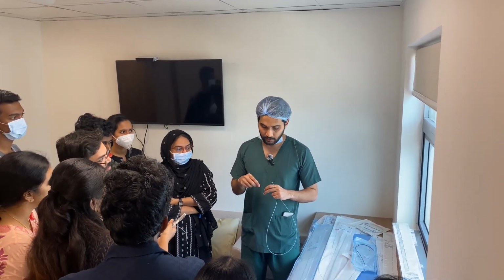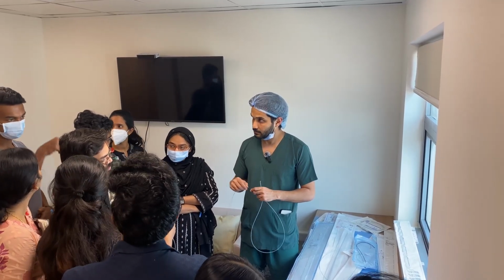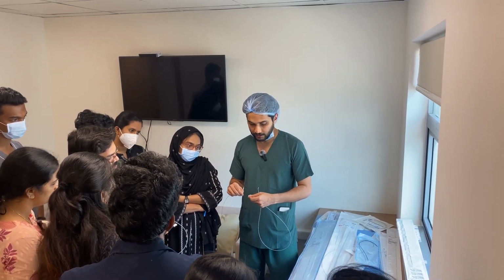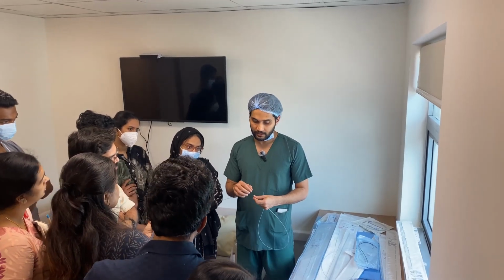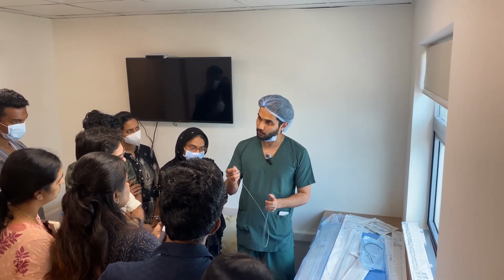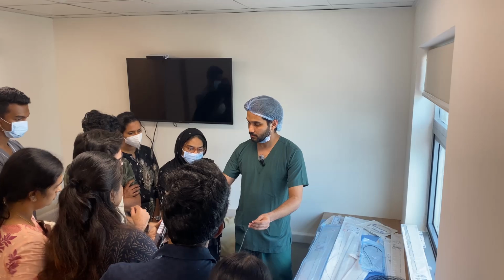ഷീത്തിന്റെ ഉള്ളിലൂടെ ഇതിടും. ഇതാണ് നമ്മൾ ഇടുക, അല്ലെങ്കിൽ ഇത് പല ഏരിയയിലോട്ട് ഫേസ് ചെയ്യും. ആദ്യം ഗൈഡ് വയർ ഇട്ടിട്ട് കൊണ്ടുപോയി, കത്തീറ്റർ എവിടെയാണോ എത്തിക്കേണ്ടത് ആദ്യം അവിടെ വയർ കൊണ്ടെത്തിക്കും. എന്നിട്ട് അതിന്റെ മുകളിലൂടെ കത്തീറ്റർ. കത്തീറ്റർ വയറിടുന്ന സമയത്ത് ഇതിന്റെ ഷേപ്പ് മാറി. ഇതിപ്പോ എവിടെയും ഹുക്ക് ചെയ്യില്ല, സ്ട്രെയിറ്റ് പോകും. അതാണ് ഒരു പർപ്പസ്. അപ്പോൾ പഠിച്ചോ.